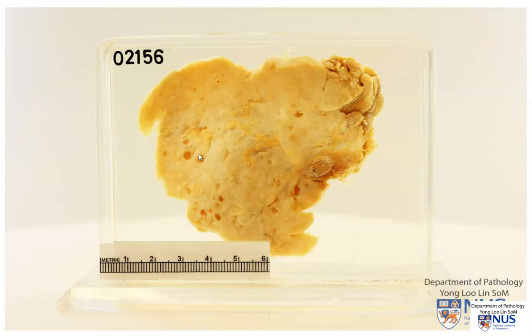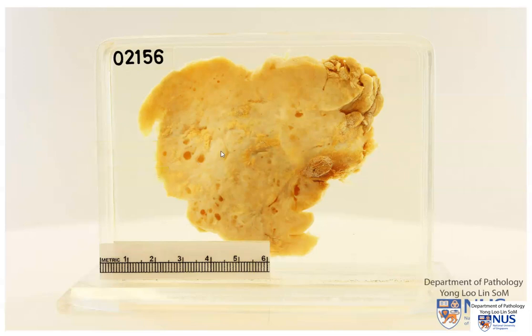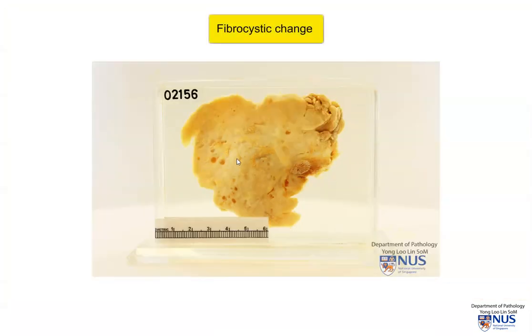In addition, we can also see these pale brownish rounded spaces, and these are cystic spaces. In the fresher specimen, before these spaces were cut open, they may have appeared somewhat bluish because of the turbid fluid that they contained. So here we have an example of fibrocystic change in the breast, and this is a benign condition.